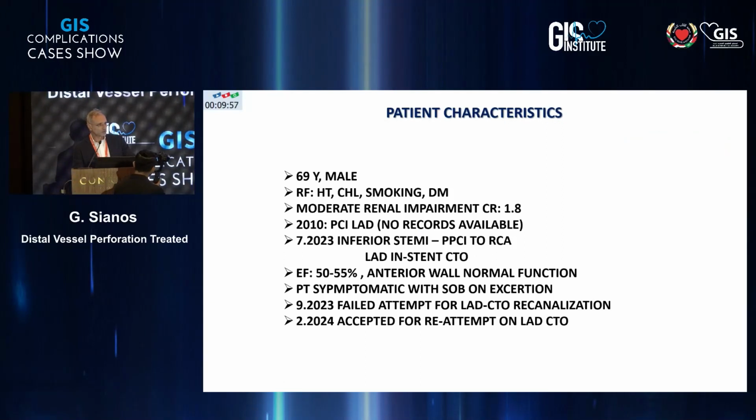From the case that you are going to see, Professor Grant has to be blamed for at least 80% of this, and I will explain the reasons as to why. First of all, he was visiting us and we gave him the prime time, and we started the CTO procedure at 3 o'clock in the evening for the consideration, which always has to be part of what is happening.